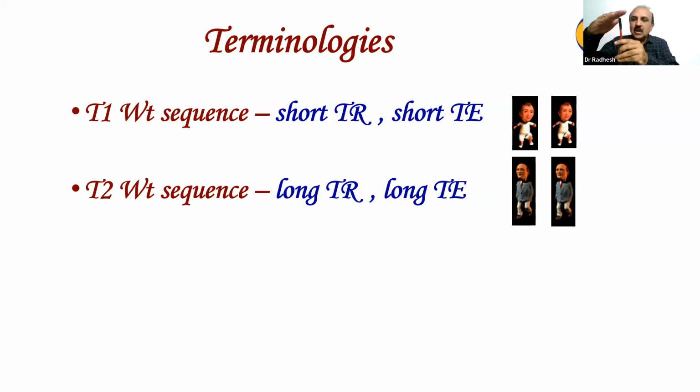That is known as long echo time. So I bombard this longer and I allow the hydrogen to come back for a longer time. That is known as the echo. So that is long TE.